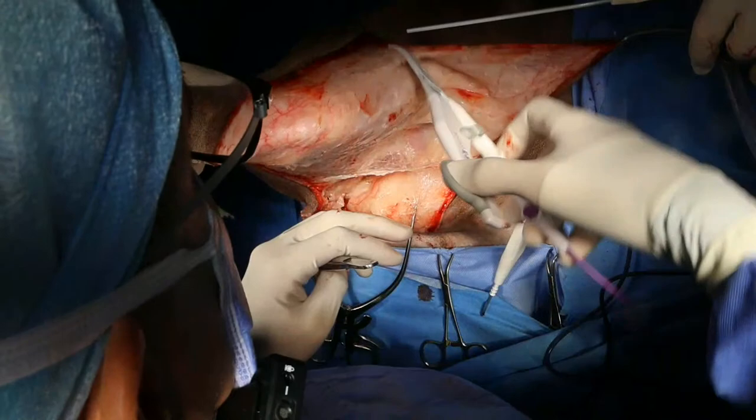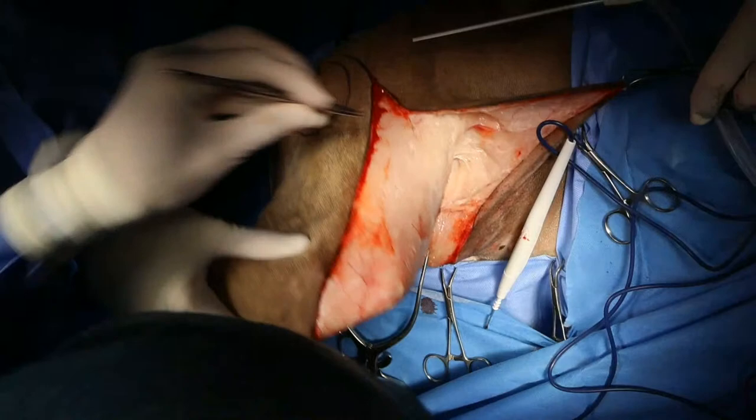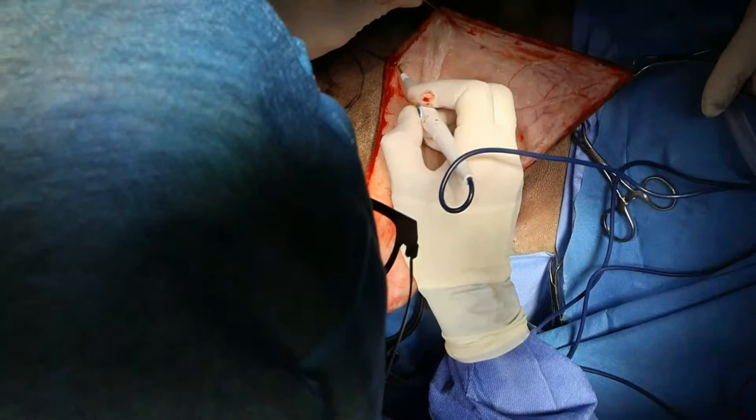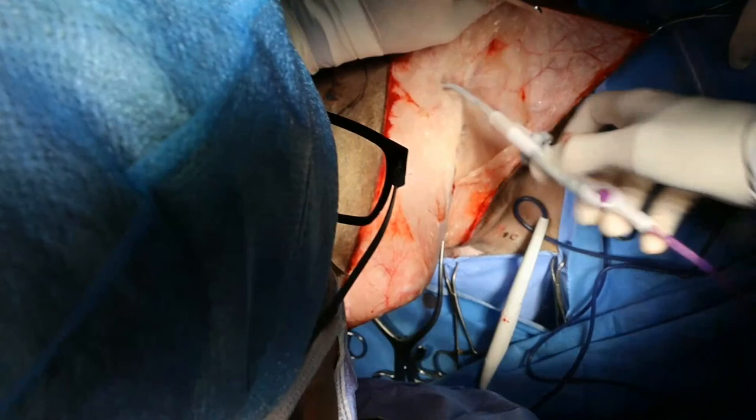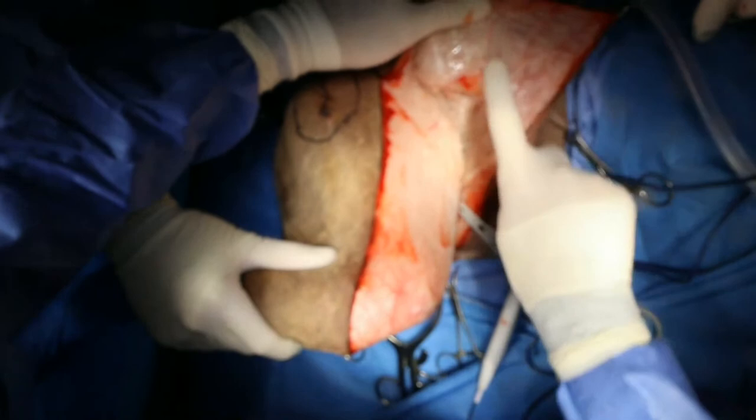And my goal with these is always to do a bloodless surgery. So my goal is to use only one lap sponge for the whole surgery. I don't always succeed, but it's just a matter of being slow and deliberate and trying to ligate our vessels before we transect them. And you can see in here just a very robust blood supply to our flank fold flap, and it's no wonder they survive.